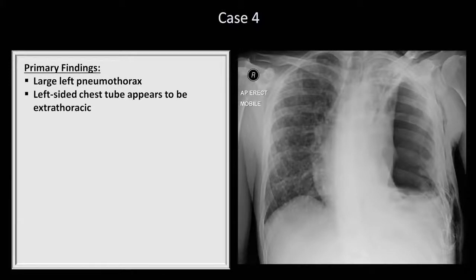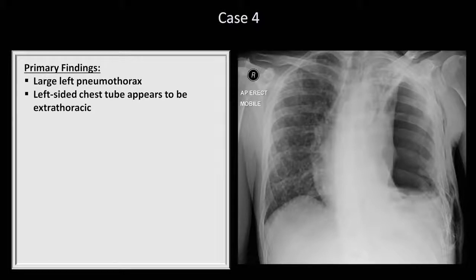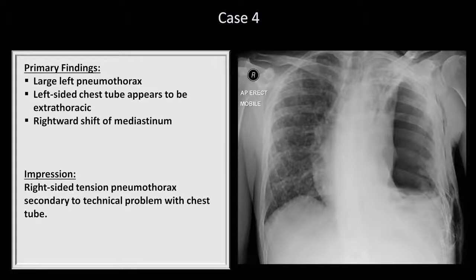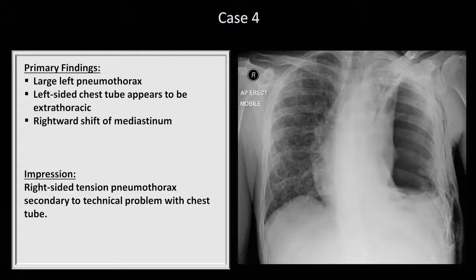As bad as a pneumothorax this large would be normally, his situation is even worse, as the rightward shift of the heart and mediastinal structures strongly suggests he has a tension pneumothorax. In a tension pneumothorax, air can continue to leak into the pleural space but it can't get out. As the pressure builds, it shoves everything else out of the way and impairs cardiac filling to the point that cardiac output and blood pressure start to drop. This is a true emergency in which the patient may have only minutes to have the lung decompressed.